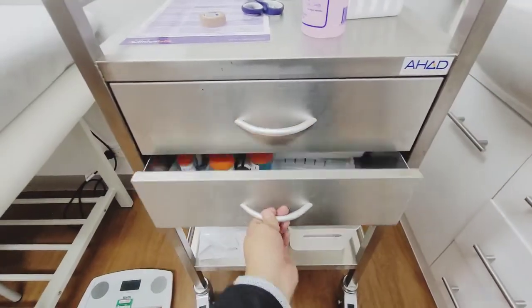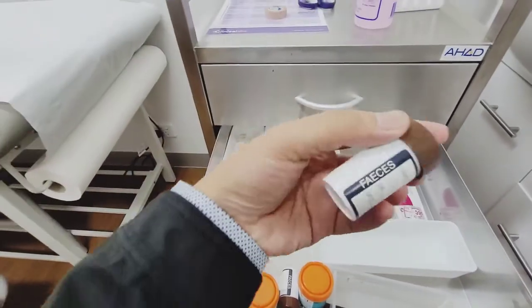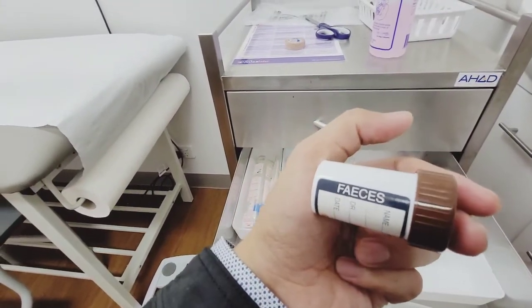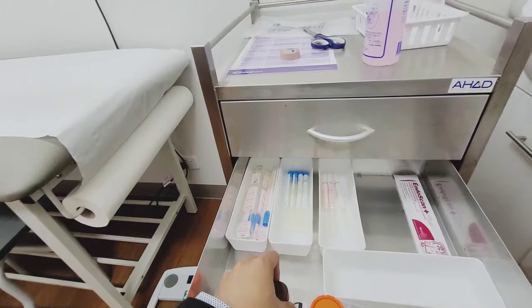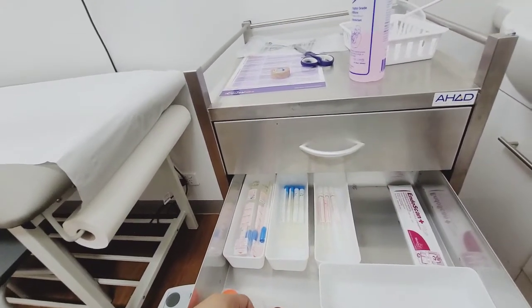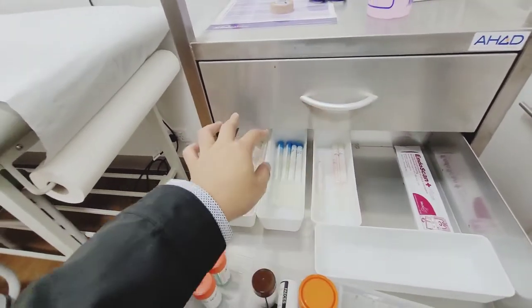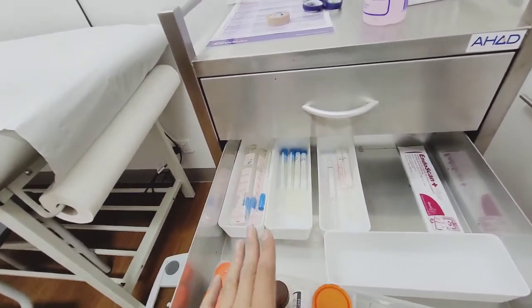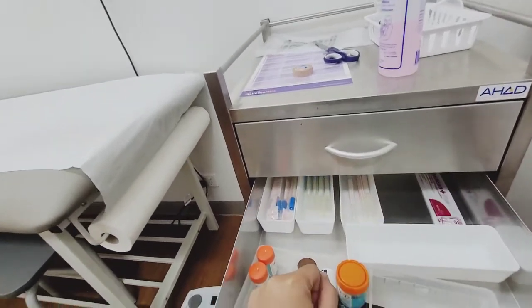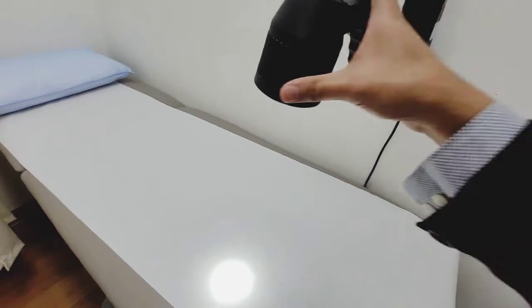Then I have some swabs here for pathology. This one is for, as the name says, feces. If I need you to provide a stool sample because you have blood in your stool, then we need that investigated. And then we have different swabs here. We have internal swabs, which we can use for vaginal swabs. If you have vaginal infections, then I can do that. You lie flat here, and then we use the light and do the swab.